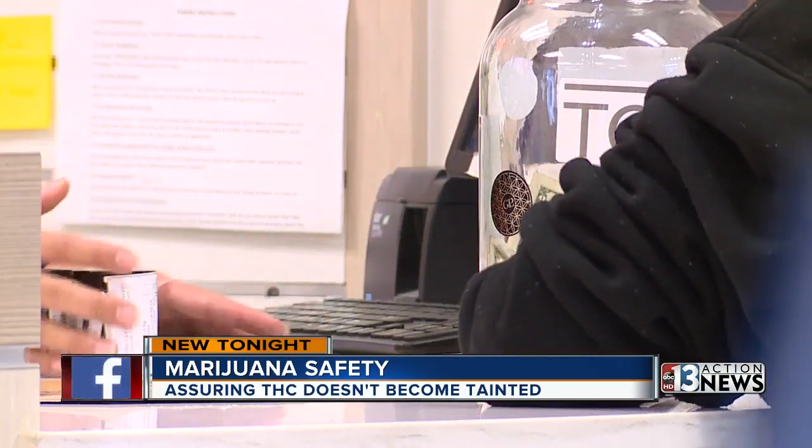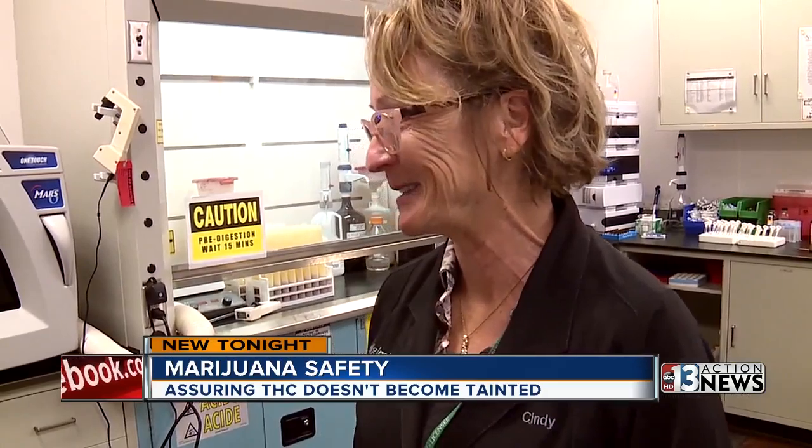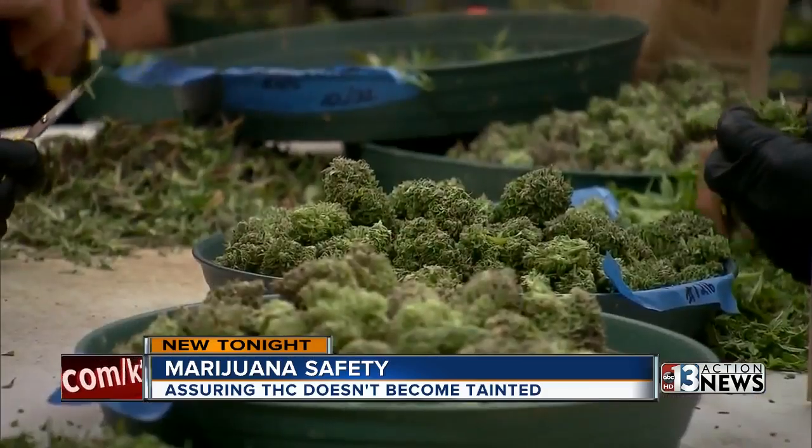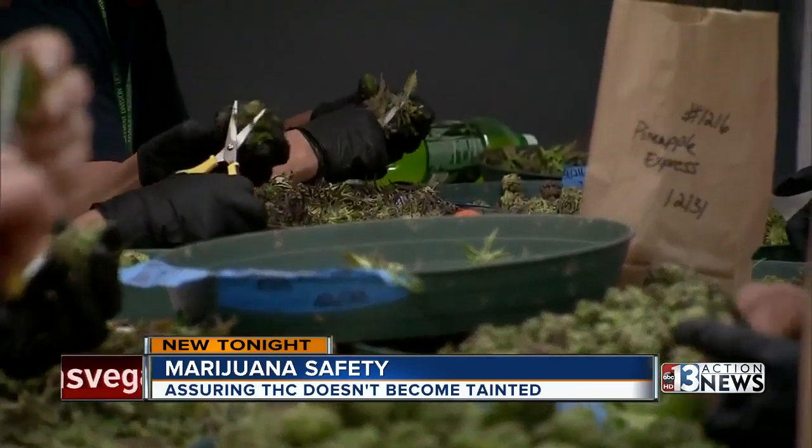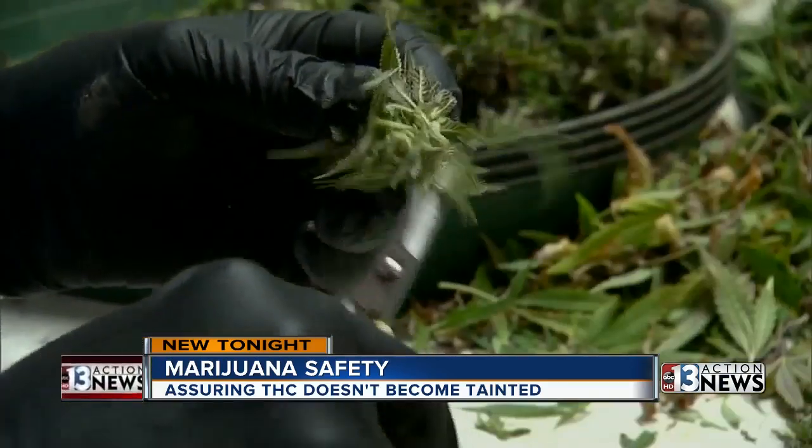But we absolutely know it's toxic, so we should be testing for it. She's talking about chromium, which can get into pot products produced using stainless steel equipment. There can be sloughing from stainless steel, and we in fact are starting to see some chromium and nickel. So I would hope that the state would add those two heavy metals to the list.